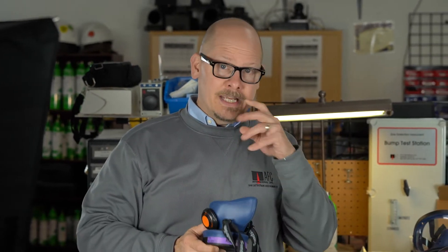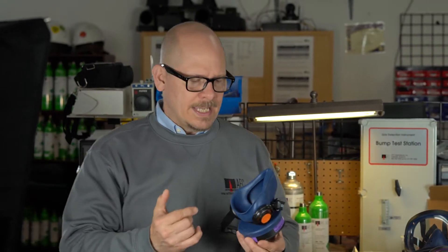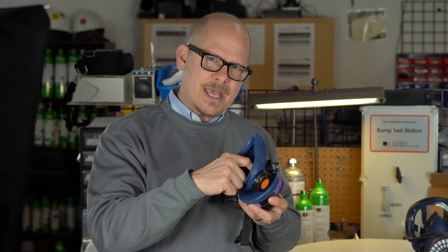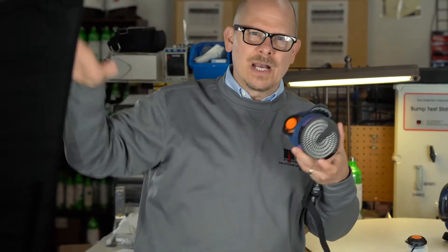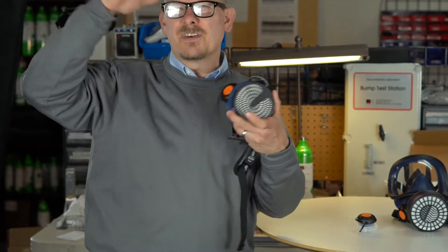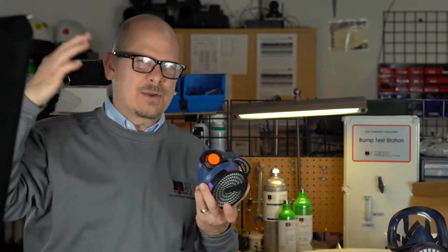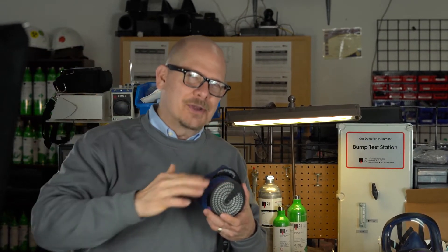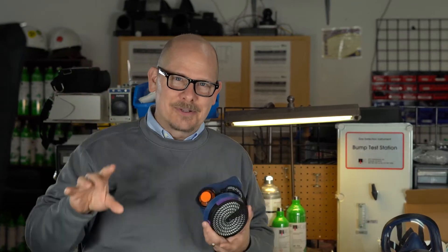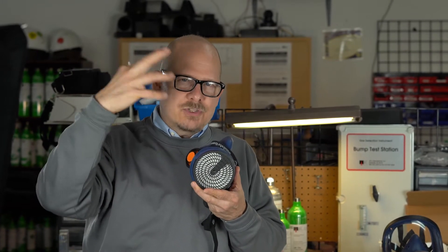If I'm going to do a quantitative fit test, I'm going to have to have a probe. What does a quantitative fit test do? It's counting the particles inside the mask while you're wearing it, then comparing it to particles that are always around us in nature. We always have a high number of dust particles. If I took a particle count of my office here, it's dusty — like those particles you see when sunlight comes through the window.